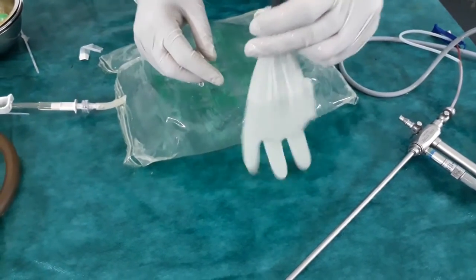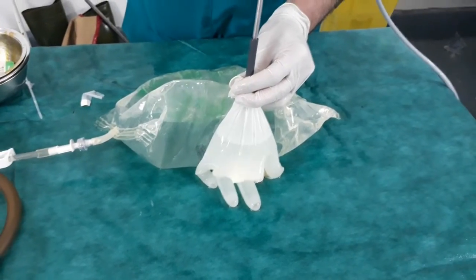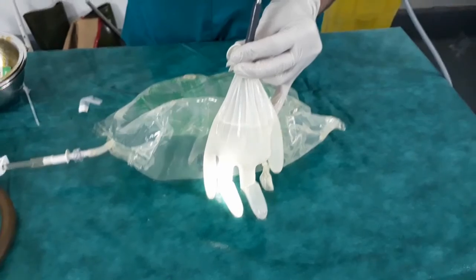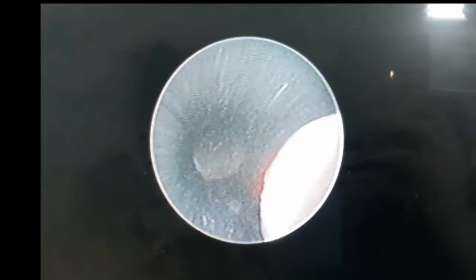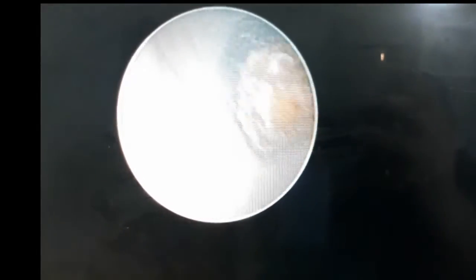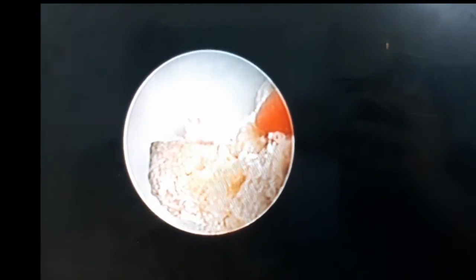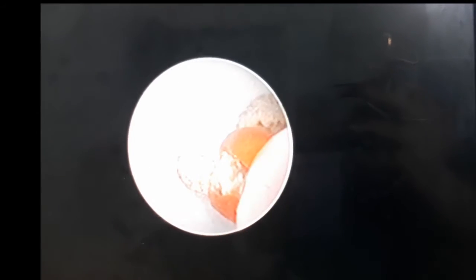The three prongs forceps is tried through the nephroscope in our endoscopic glove model. The stone is found. The three prongs are opened. The stone is caught between the prongs. The prongs are closed. The nephroscope is withdrawn extracting the stone.